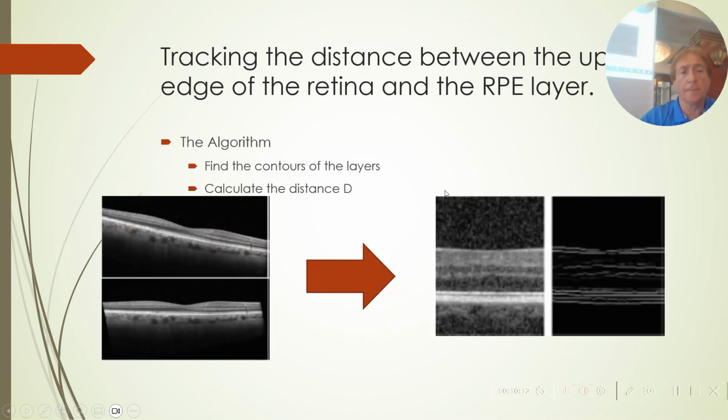So how can we calculate this distance? For this, first of all, this is our retina, and we should bring it into a horizontal position just by turning it.